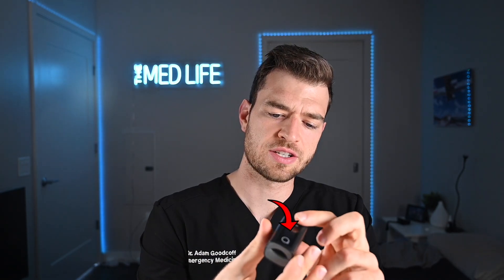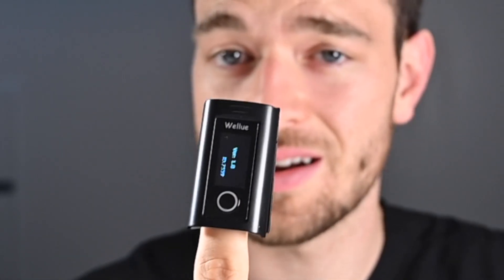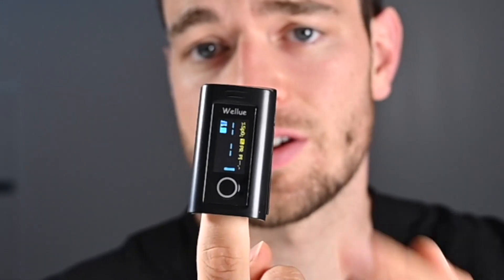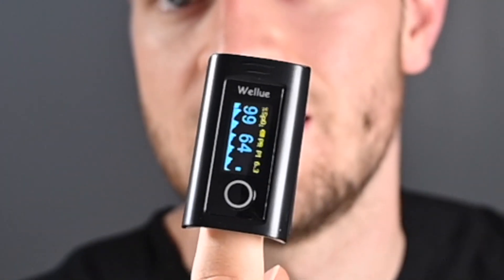Last but not least is the mighty pulse oximeter. Everybody knows about pulse ox this past year because of oxygen saturation. This little device is really cool — it's easy on, easy off, just like the ones in the hospital; it kind of clamps down on your finger. As soon as it clamps down and notices your finger is in there, it will turn on and start to obtain a pulse ox reading. You can actually look at the waveform down here, which I think is really, really good.